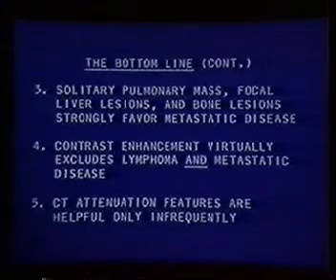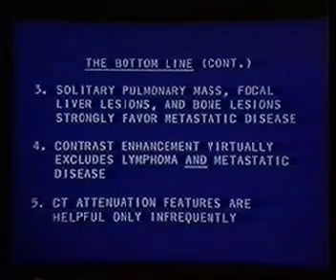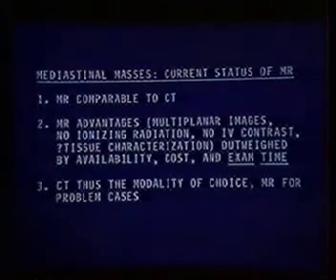But it turned out that in the group as a whole, I think we were only able to make relatively specific diagnoses in 16 out of 133. So I would say that we wouldn't want to overdo our enthusiasm about how well CT is allowing us to make extra diagnoses. It certainly gives us much better information than conventional radiographs, clearly especially in the cases where the conventional radiographs are normal. But even so, it does not frequently lead to these specific diagnoses that we were hoping we would make. So I think that's an important message to take away from this.